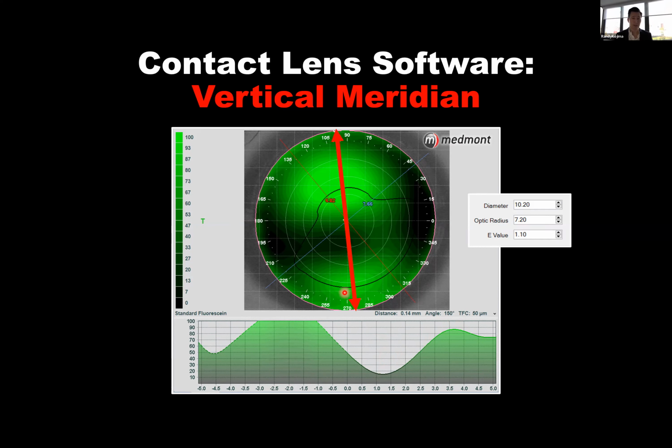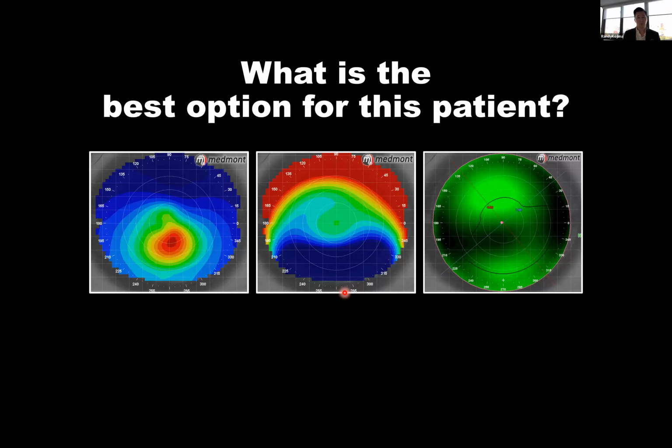We are much better served with a scleral lens. So when you look at the maps together, the corneal topographer can be a great guide of how to approach these eyes. Do I go with corneal GP or do I go with scleral? Does corneal GP have a chance? If so, we know that for the patient, it's much less expense over the course of their wear period, less in the lens, less in the fluids. If we go with scleral, the lens costs more, the fluids cost more over time. So it's nice if we can fit corneal GP more often.